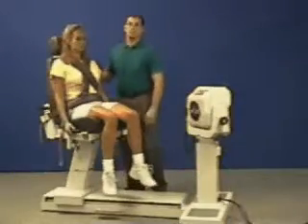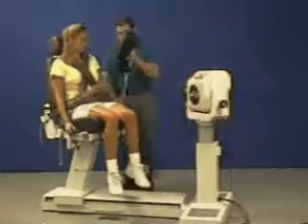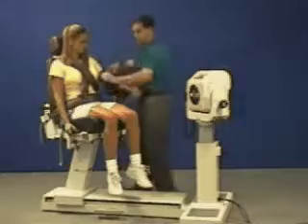Rotate chair 260 degrees. Raise dynamometer to align the axis of rotation. Install limb support angled away and strap in patient's arm.